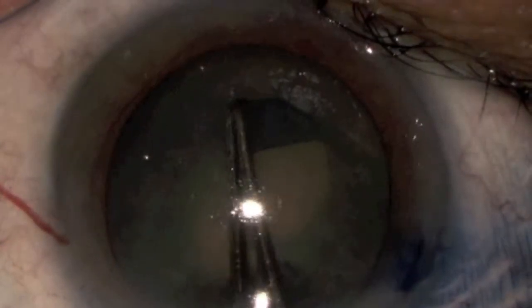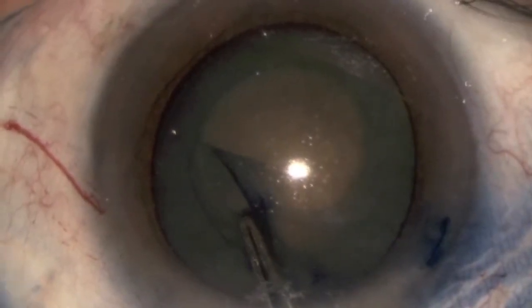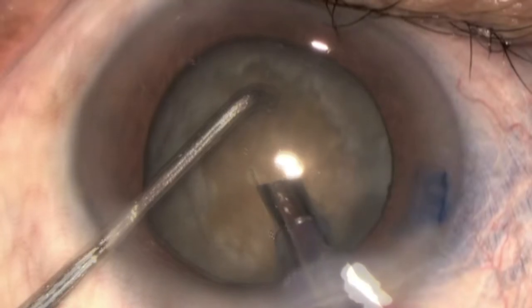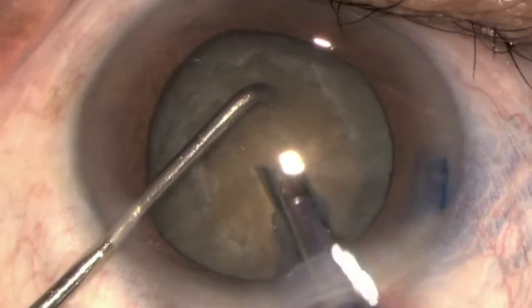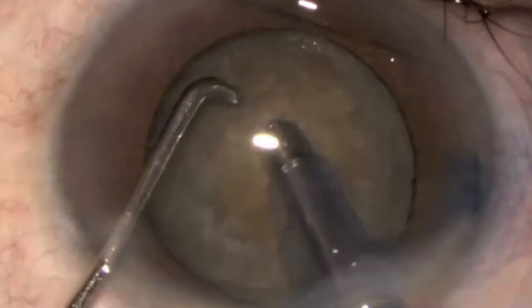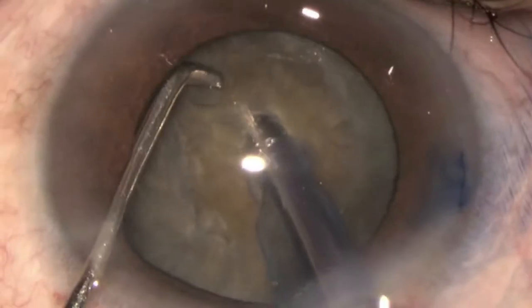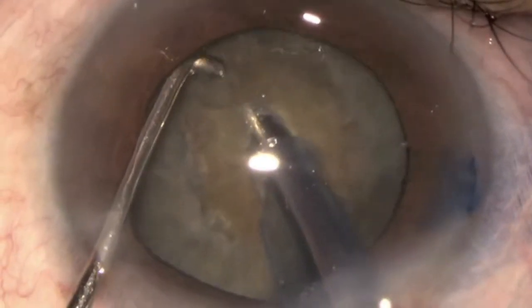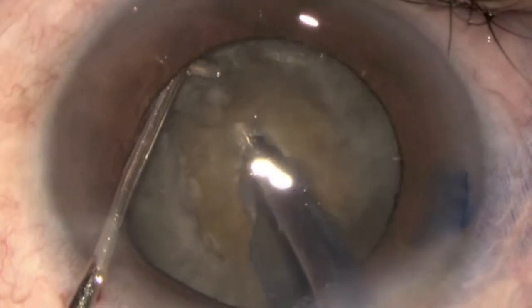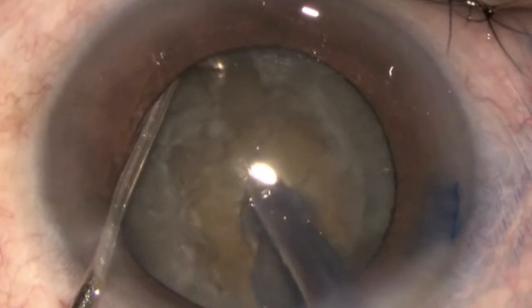To achieve perfect dynamics of terminal chop, it is important to create a large capsulorhexis with an intended 5.5 to 6 mm in diameter. Once the capsulorhexis is complete, a short superficial central trench is sculpted in the nucleus, sufficient to hold and engage the phaco tip. Then, using the hyperpulse or burst mode with high vacuum settings, the phaco tip is engaged at the distal end of the trench and then impaled full length into the nucleus, keeping the tip directed towards the equator superficially, parallel to the pupillary plane, to achieve a firm grip at the periphery of the nucleus.